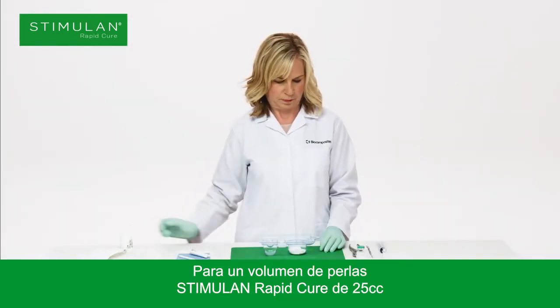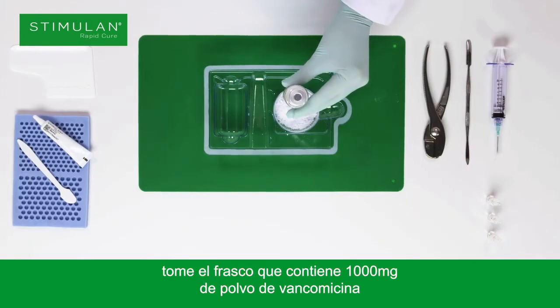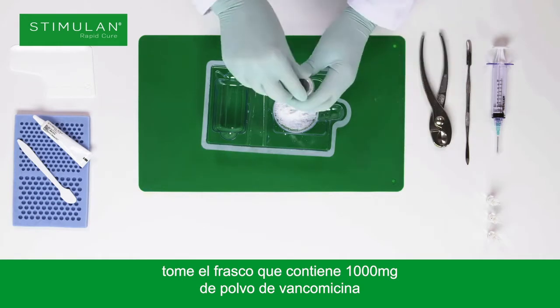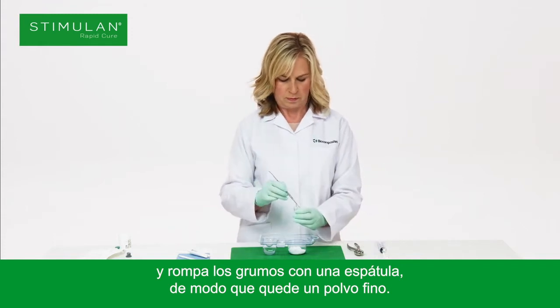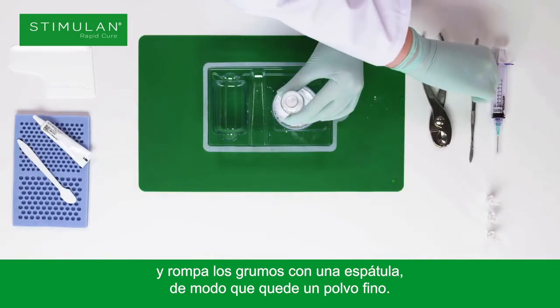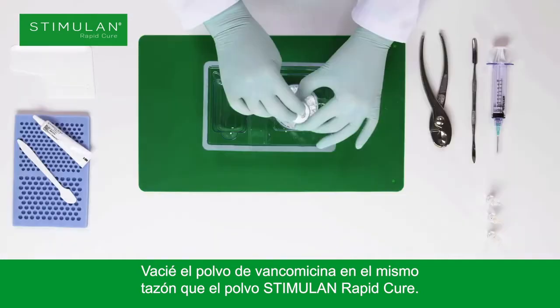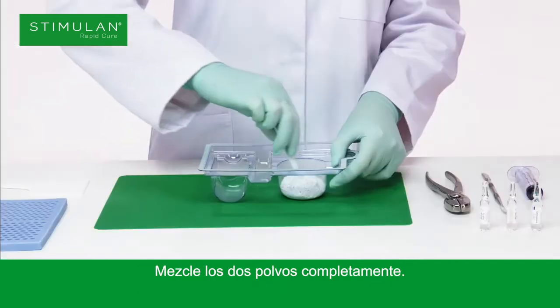For 25cc bead volume of Stimulan Rapid Cure, take the vial containing 1000mg of vancomycin powder and break up any lumps with a spatula so you are left with a fine powder. Empty the vancomycin powder into the same bowl as the Stimulan Rapid Cure powder and mix the two powders together thoroughly.